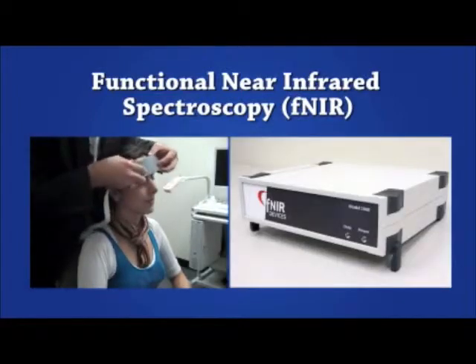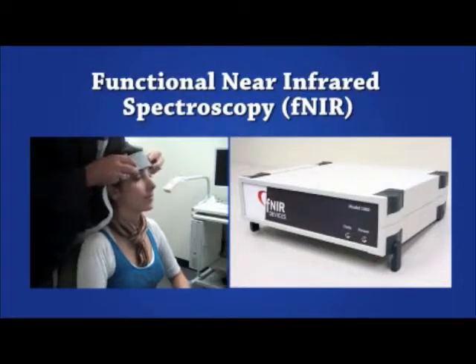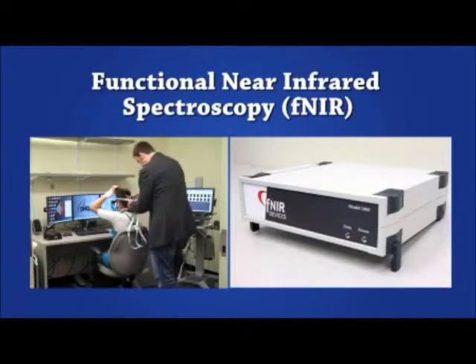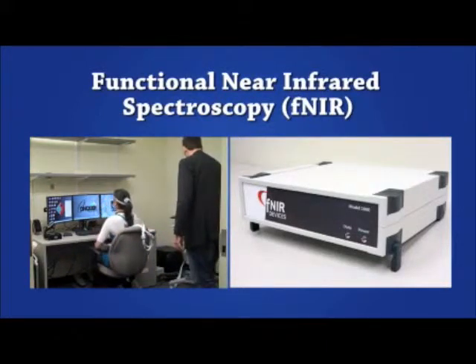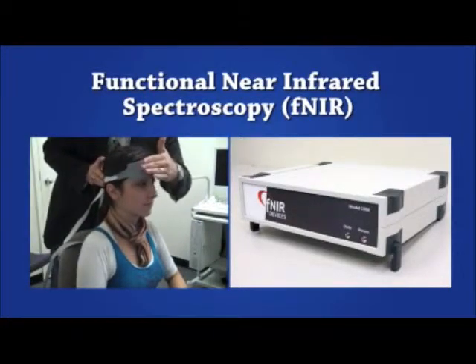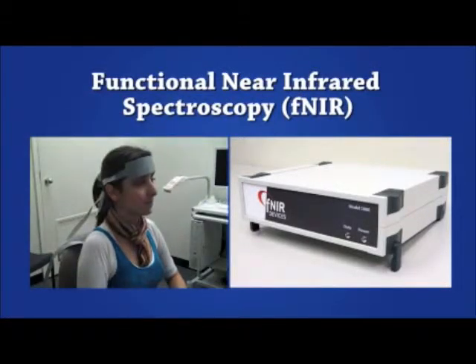In this study, we have used FNIR Devices Model 1000 that is based on the designs of Chance and colleagues in the 1990s and further developed at the Optical Brain Imaging Lab of Drexel University. This instrument does not rely on fibers or light guides to interface optodes with the skin. Hence, it is easier to set up, more comfortable for long sessions, and less prone to movement artifacts. However, this sensor is designed specifically for detection of cortical activation of the dorsolateral prefrontal cortex that is under the forehead and cannot be used in other head regions because of interference from hair.